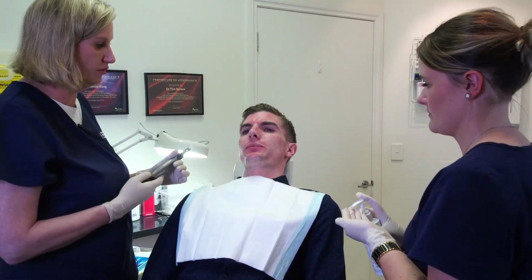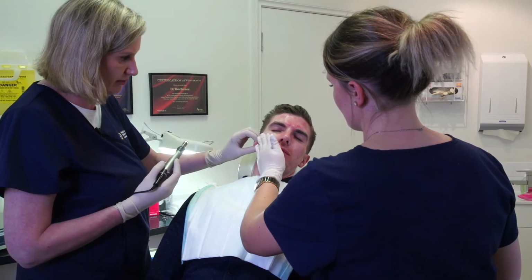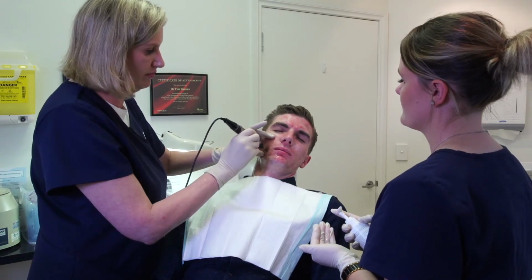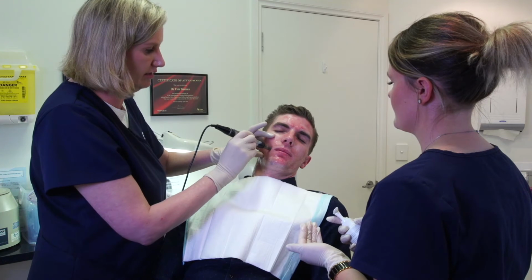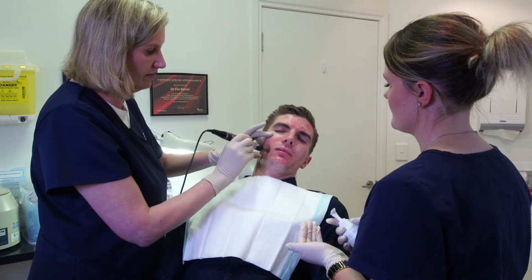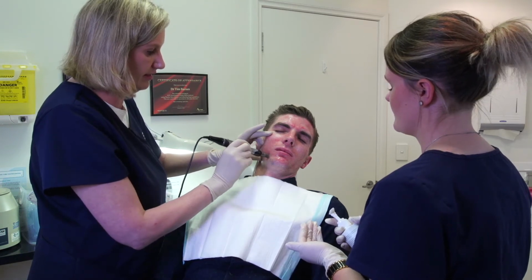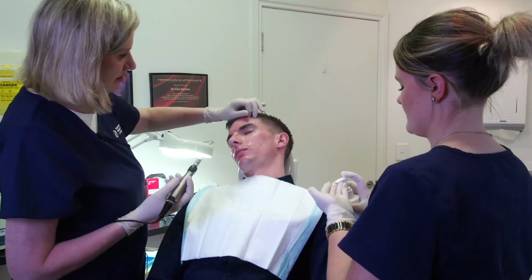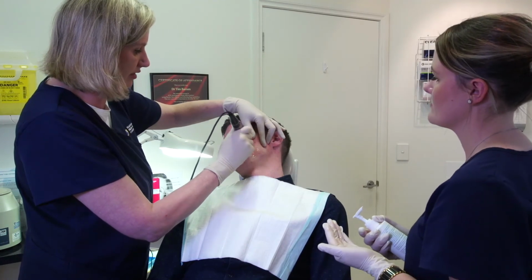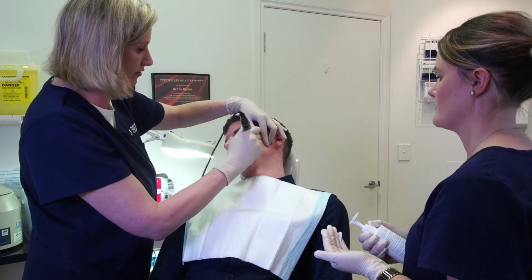Right, so we've done the whole face at 0.5mm depth. What I might do is dial up to 1mm depth and just address perhaps an area where I saw a little bit of scarring. It feels a bit, can you feel that deeper? It's a bit more prickly. And so you can see that the microhemorrhage is going to be a bit more apparent where you dial up that depth a bit more. And other side, it's just a few tiny little, very shallow scars from acne from his teenage years that will help improve around this area.